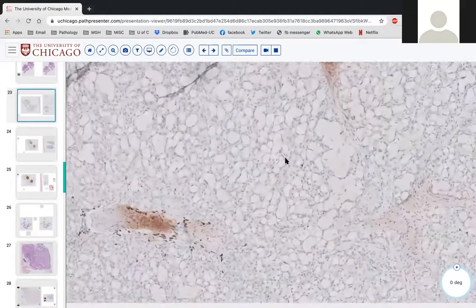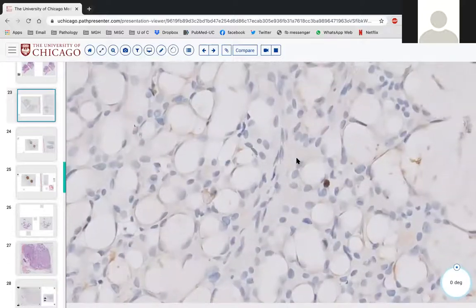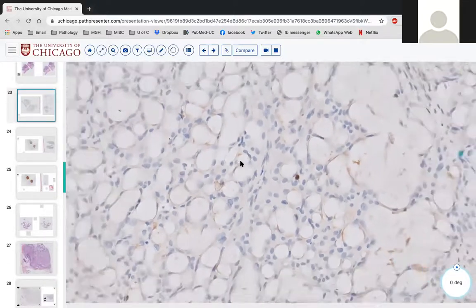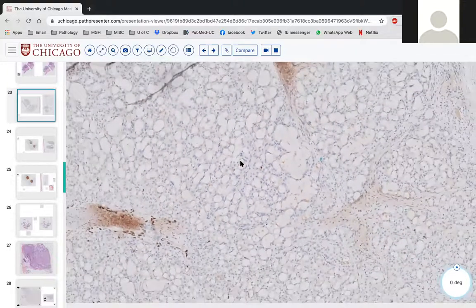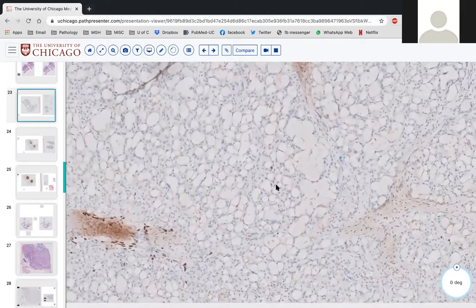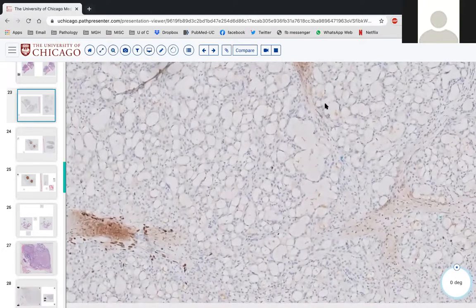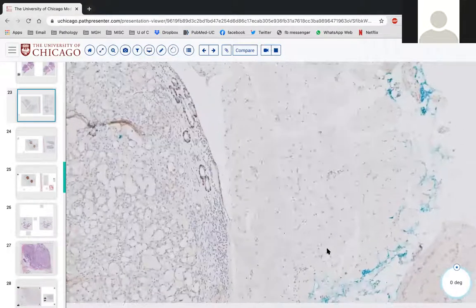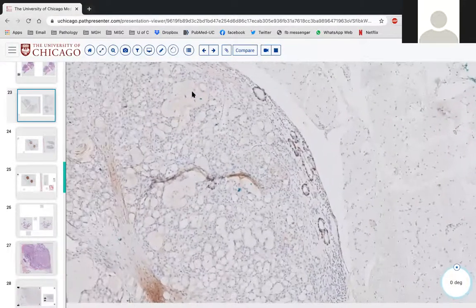So could polymorphous cribriform be on the differential again? I guess, because sometimes that one is negative for P40, although zooming in, I don't know if you're trying to show me some blush patchy staining. No, I think this can just be ignored as non-specific staining, or maybe entrapment of surrounding ducts at the periphery over here. Yeah, we definitely have some entrapment, some normal ducts.